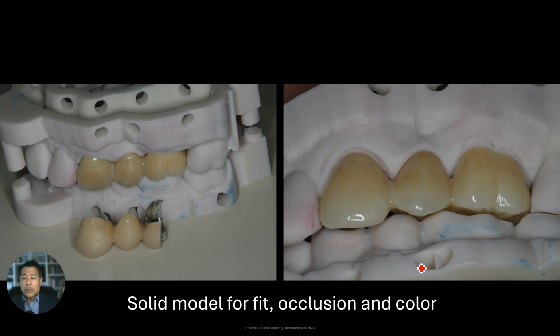So here you can see that the zirconia bridge comes back from the lab, and when that comes back, I put that on a solid model. I don't put my restorations, whether it be a single unit or multiple units like a full mouth rehab, on my Pindex models, because the Pindex models and preps could move a little bit and shift. What I want to do is put these on the solid model so I can be sure that everything fits, and it's going to minimize the probability of us having to do any kind of adjustments once the patient's in the chair.